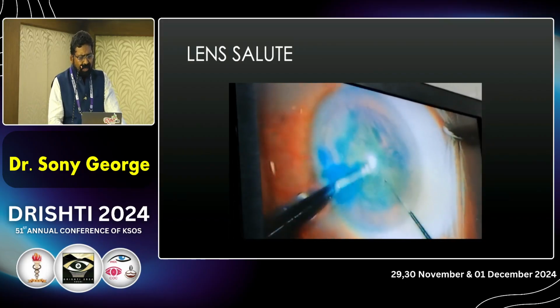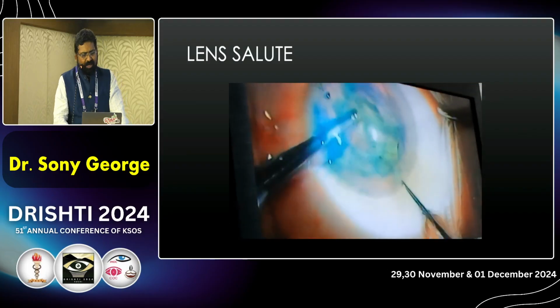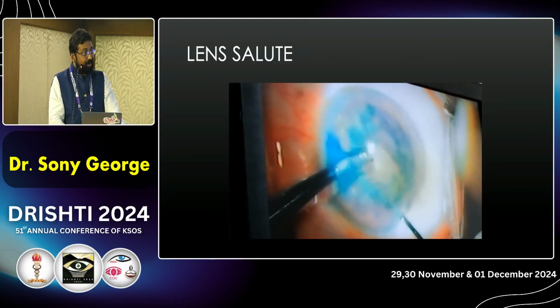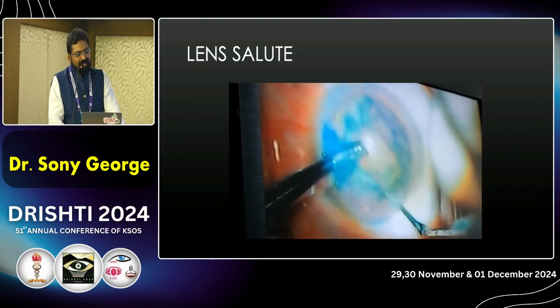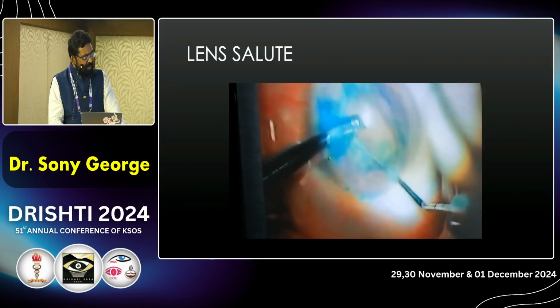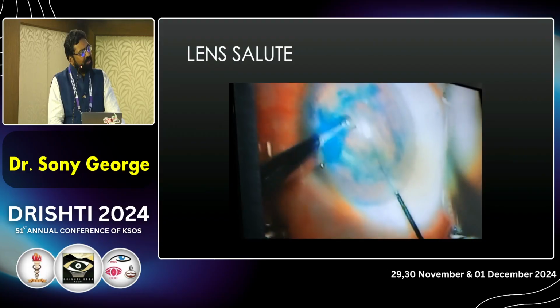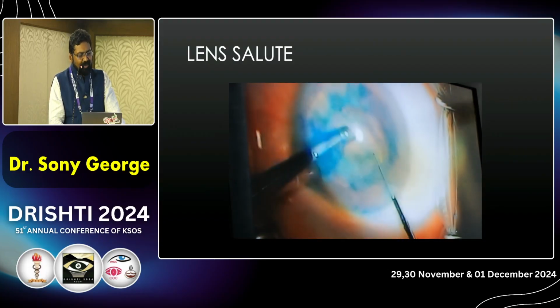So in short, these are the few techniques which you can use to make life simple in a soft cataract. And whenever needed, please go ahead and use iris hooks or rings and OVDs in plenty so that you don't end up in a problem.